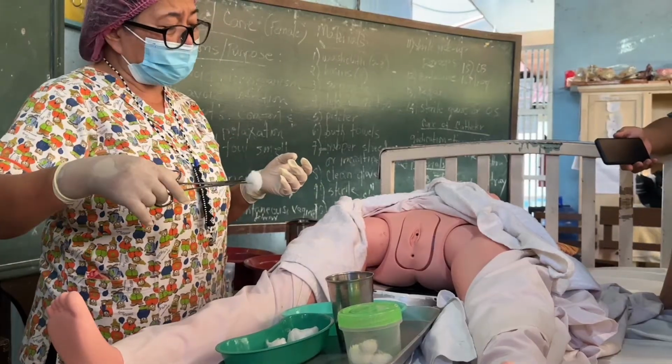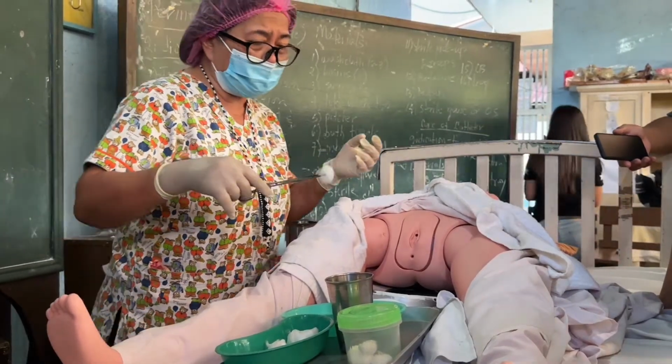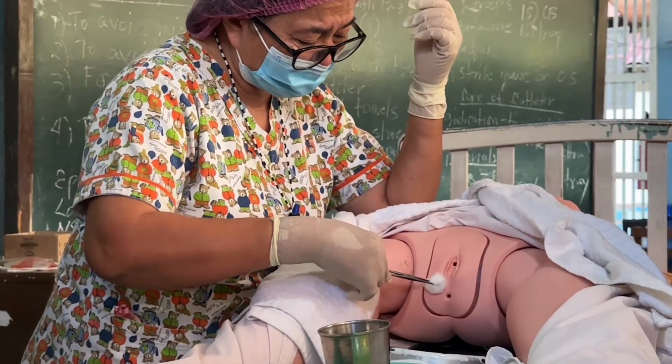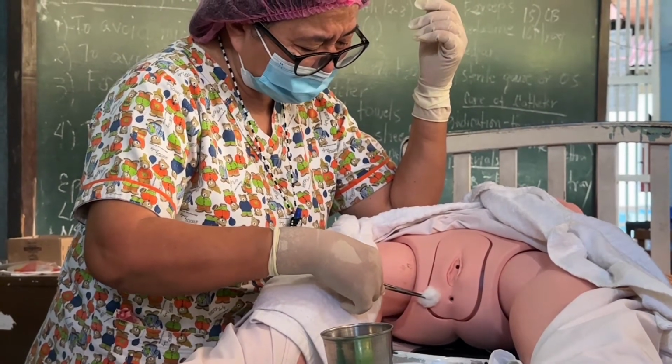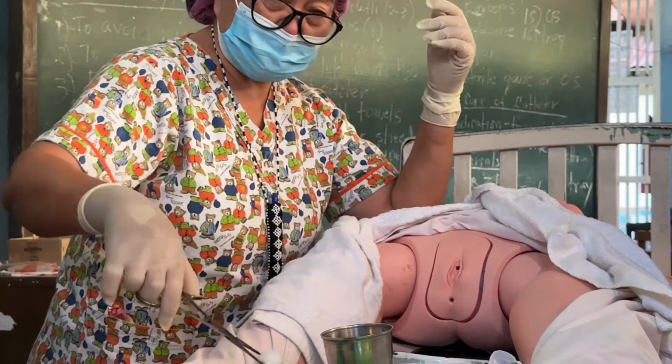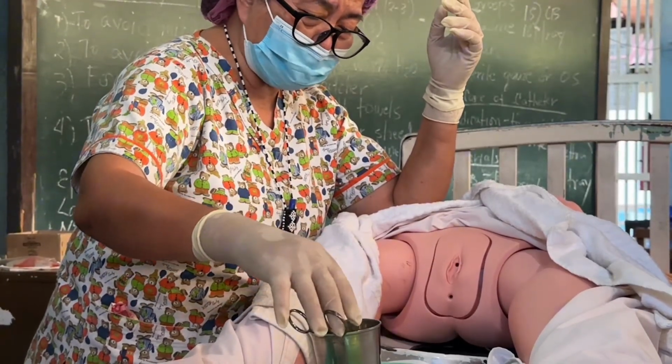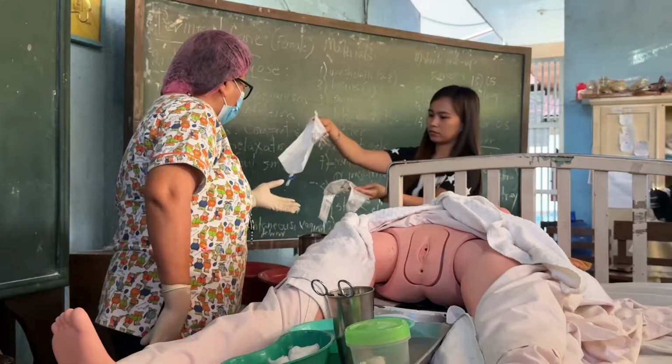I'm going to paint the episiotomy wound with cotton balls with betadine here. Okay. But at least 3 times. Okay, so at least 3 times na. Okay, done. Now I'm going to proceed with catheter care.